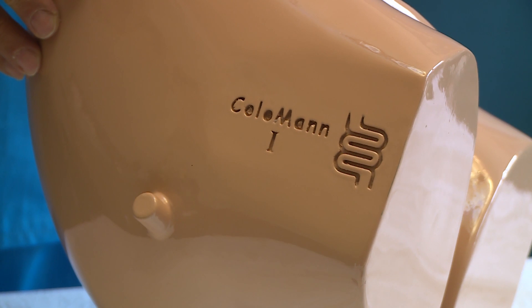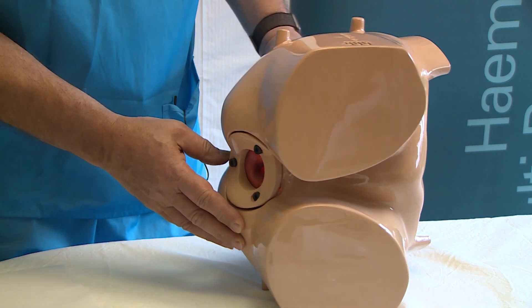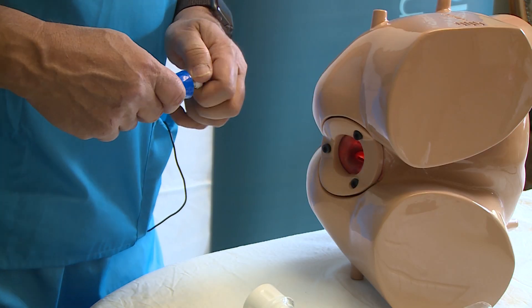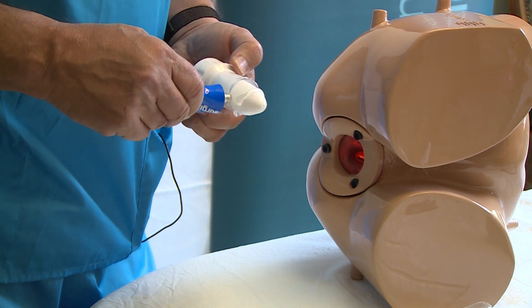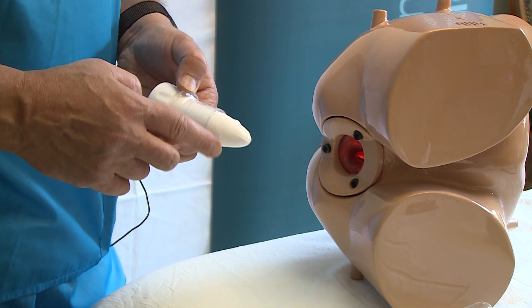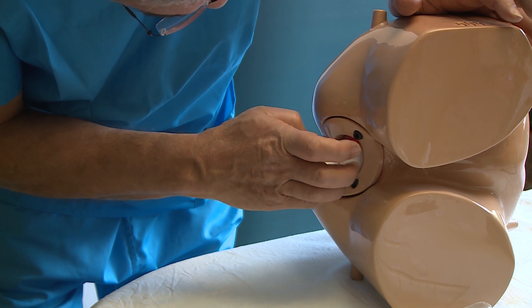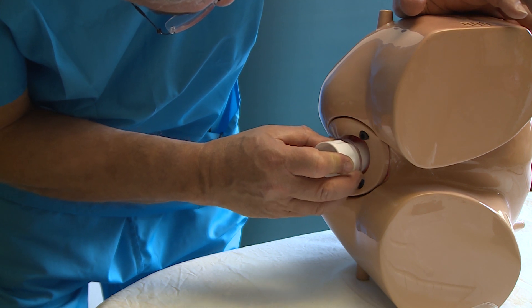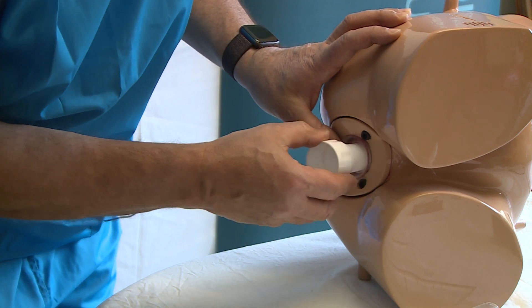I will demonstrate the procedure on a specially made mannequin, Coloman 1, designed for training on this procedure and for training on banding hemorrhoids. We start by applying a generous amount of lubricant to the trocar and part of the sleeve, then introduce it very gradually into the anal sphincter to dilate it gradually and reduce patient discomfort. As soon as it is fully introduced, we remove the trocar.